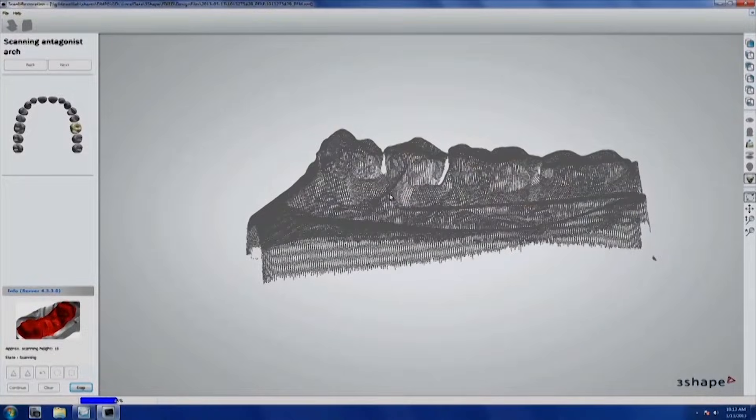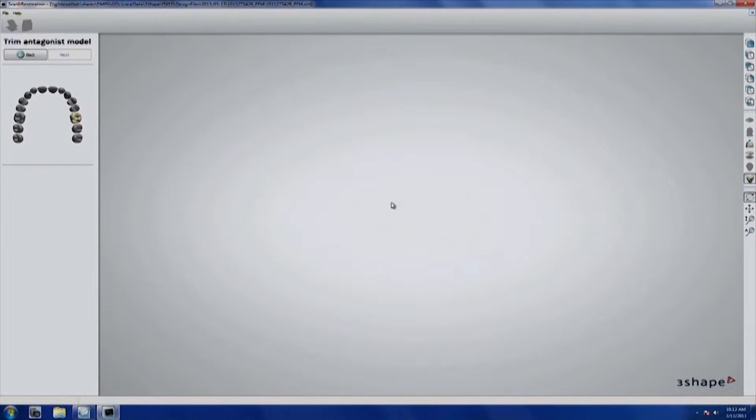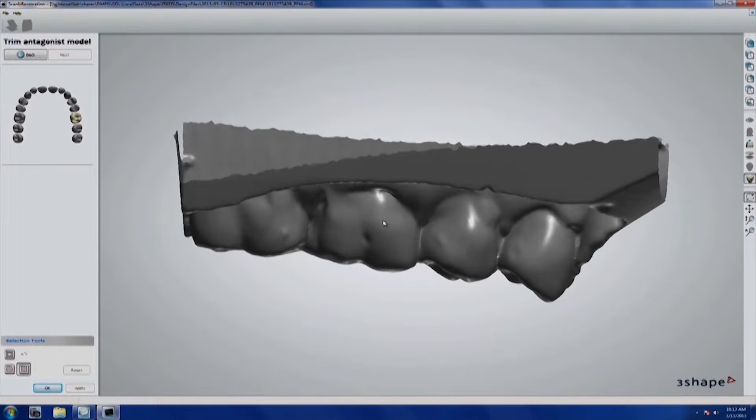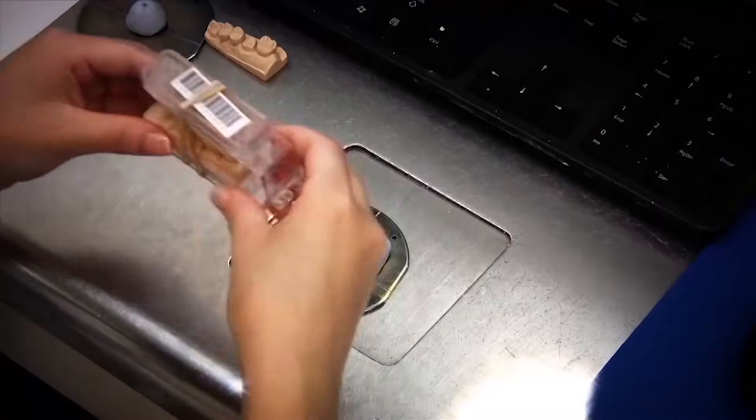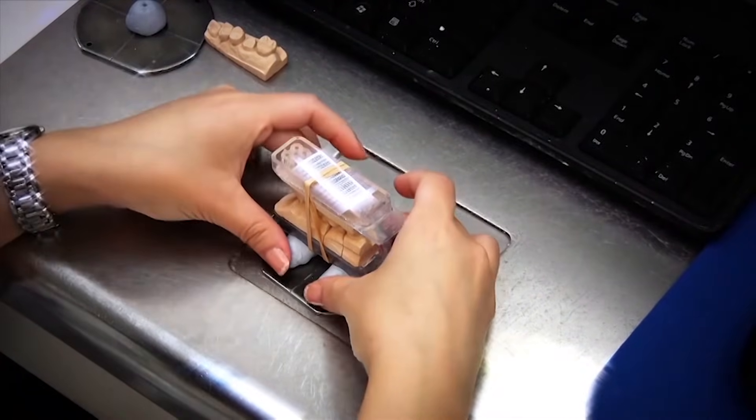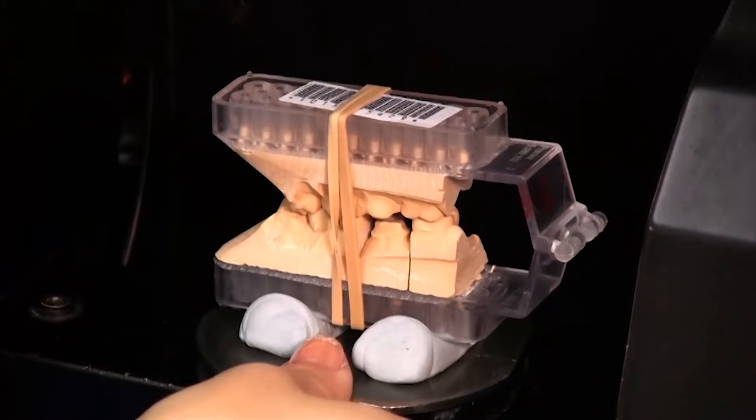And now we're going to scan it and bring it into the digital environment. So it's going to look like the dentist took a digital impression in the mouth. It's just that we had to do it ourself. And it's not quite as accurate as if the dentist did it in the mouth, to be honest, because there's distortions in polyvinyl and dental stone.